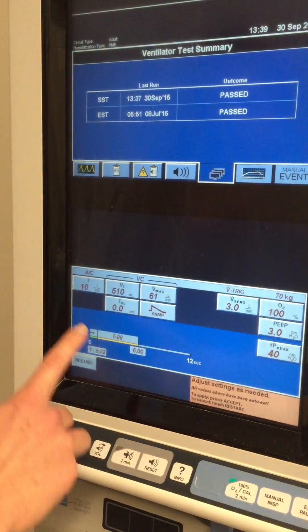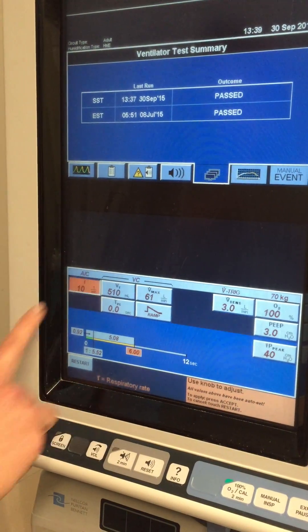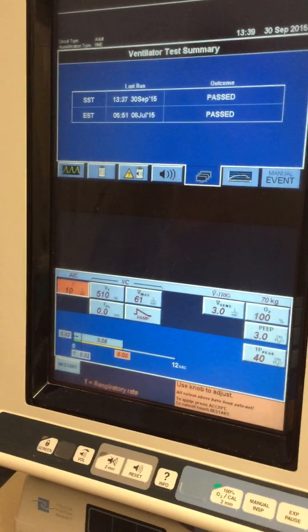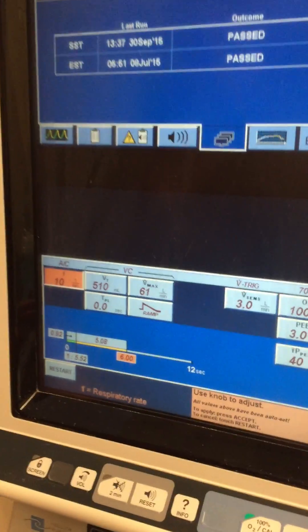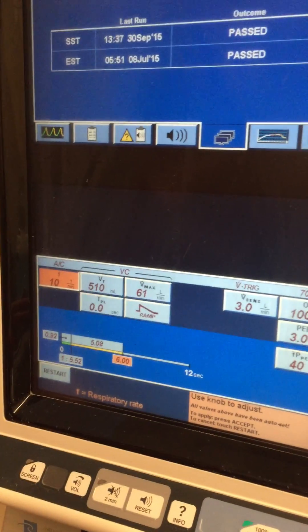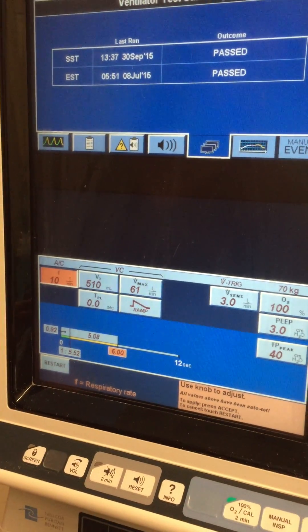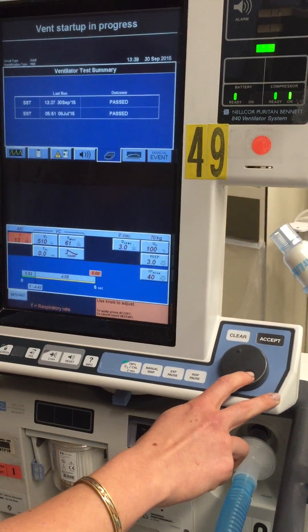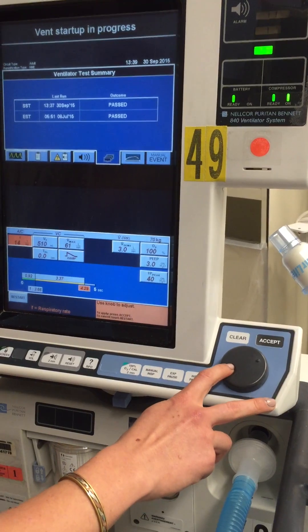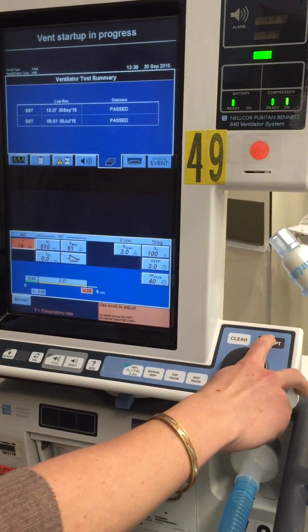From here, it starts asking you about the different settings. For the frequency or the respiratory rate, we're going to use the knob to go up or down on what we want. We'll just put it at 14.